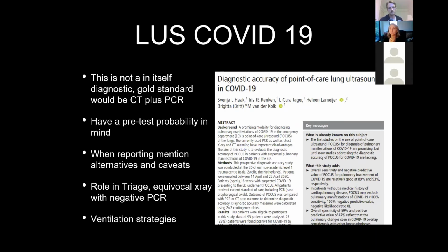We felt like it had a role in triage right at the beginning of the pandemic, where we didn't have any point of care testing, and we were scanning people in the ambulance, and based on their pretest probability and what profile they had, they were cohorted to hot or cold areas. And we found that did have quite a good sensitivity during the peak of COVID, and the specificity just started to drop as the cases dropped, as you would imagine.